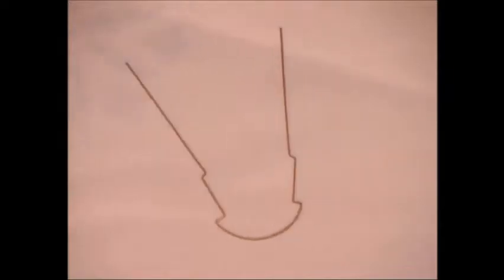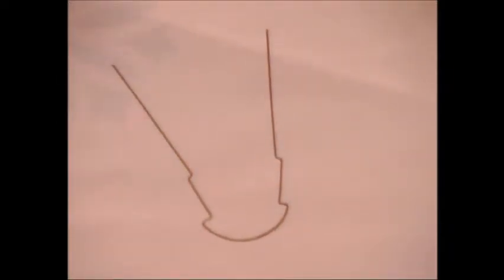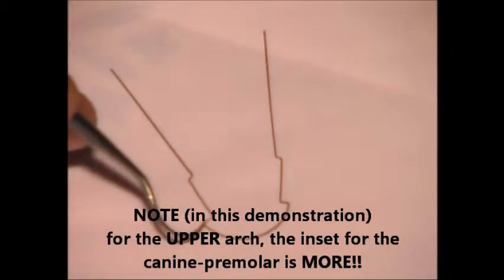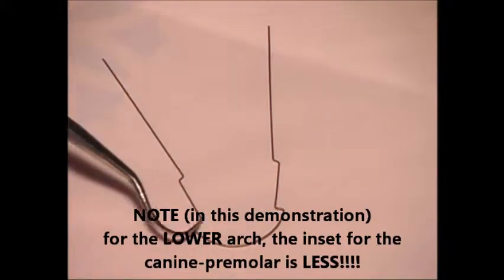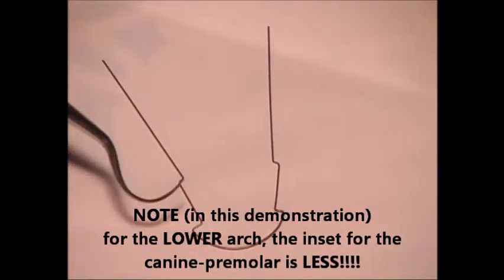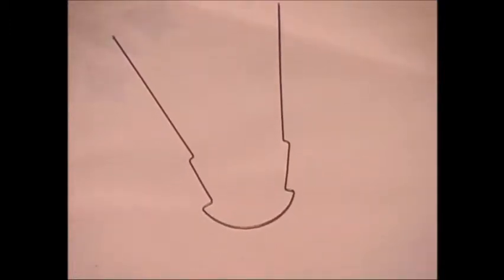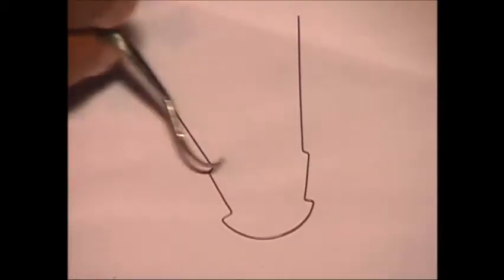Now you can see this wire — for the canine, the inset is more here. The canine premolar inset for the upper arch is more, and this is for the lower arch, this is less. This will also depend on how much you want to correct. Sometimes in some cases you might not have to correct, if the bond thickness is the same, or you can give this.